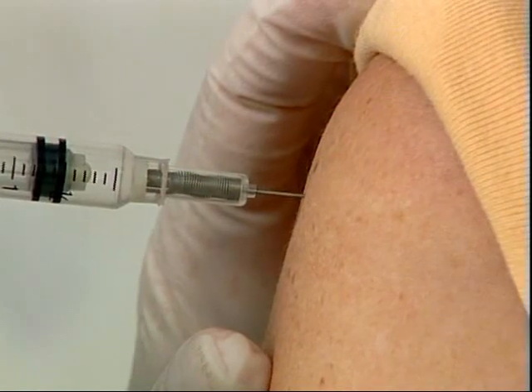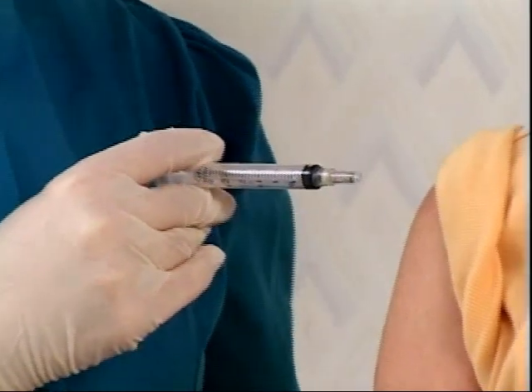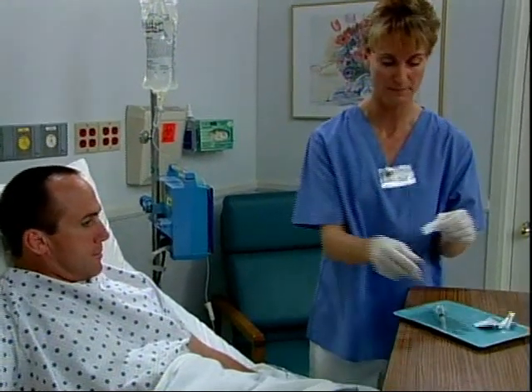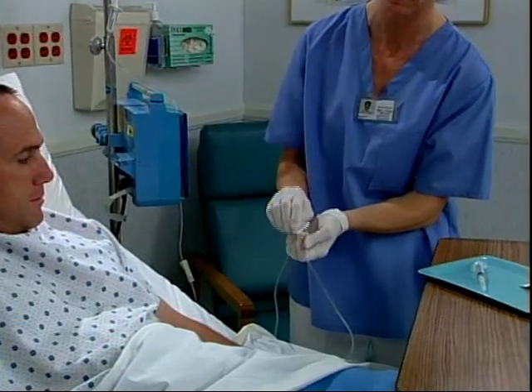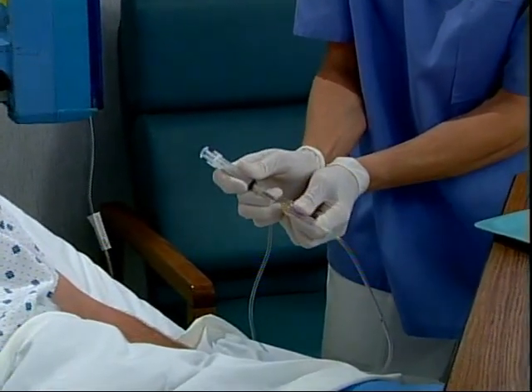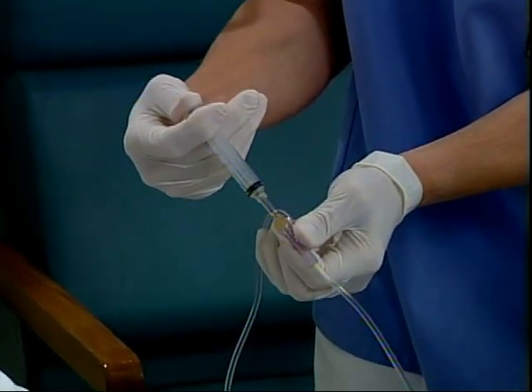The VanishPoint syringe's built-in spring is sufficient to withdraw the needle from most injection sites. However, if an injection site is unusually dense, the retraction may be slowed. When injecting into pierceable IV ports, the gentle spring action of the VanishPoint syringe cannot withdraw the needle. For injections into pierceable IV ports, simply remove the needle from the port as soon as the plunger has been fully depressed. The needle will then automatically retract.